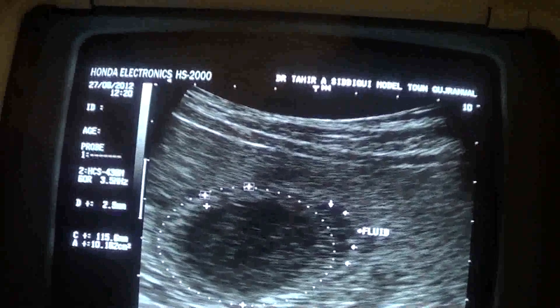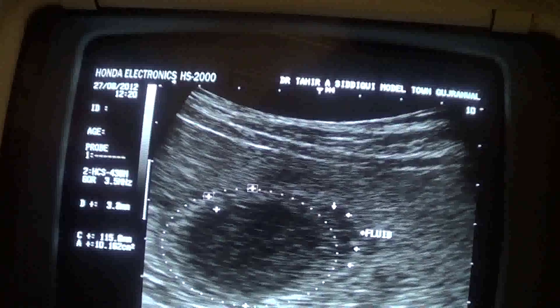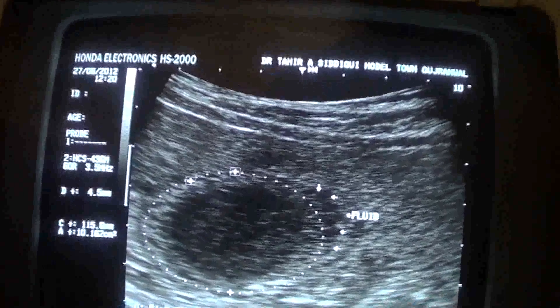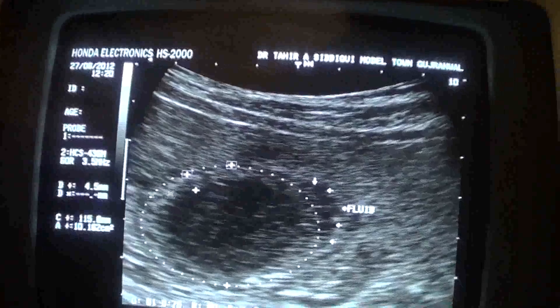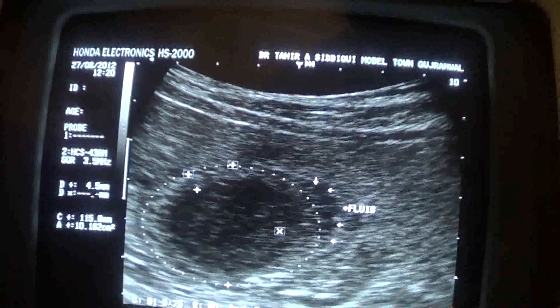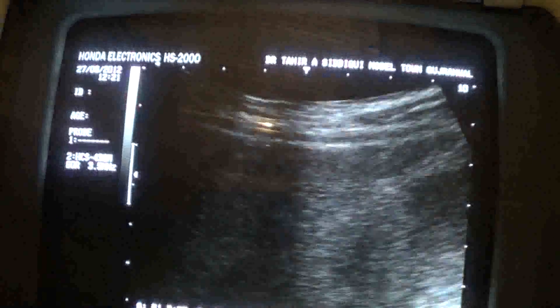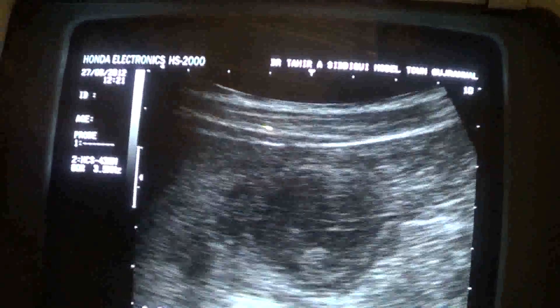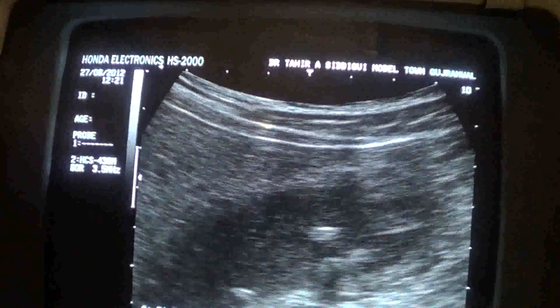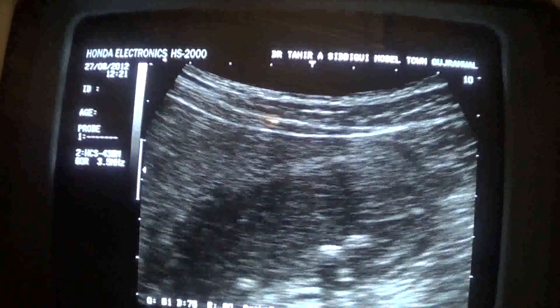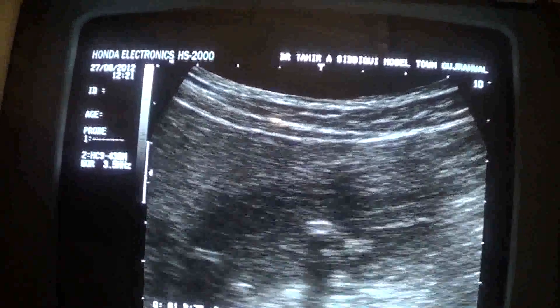The gallbladder wall is thick — in this section it measures 4.5mm. The lumen is filled with sludge and debris, and this is a case of pericholecystic fluid.